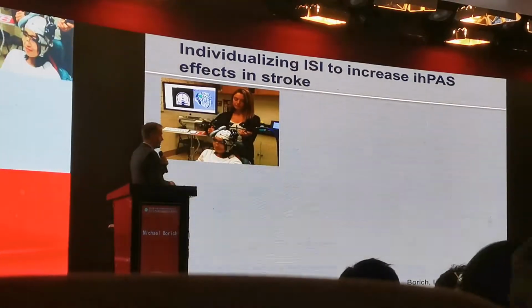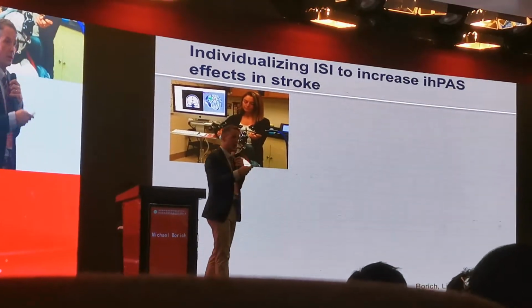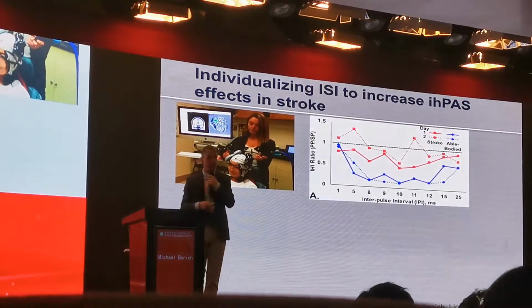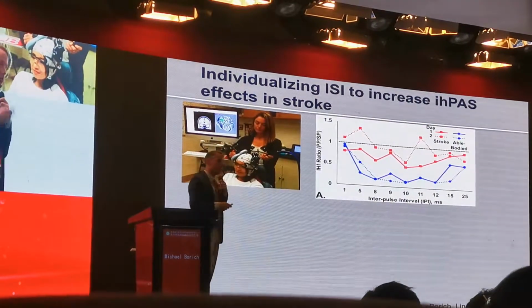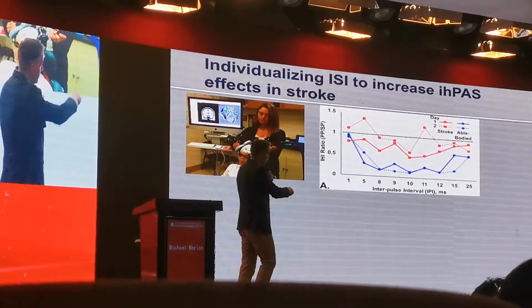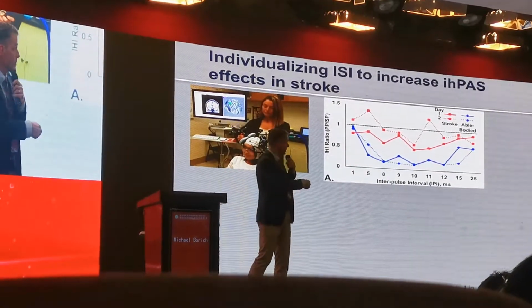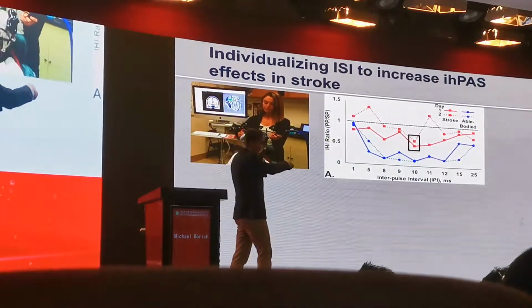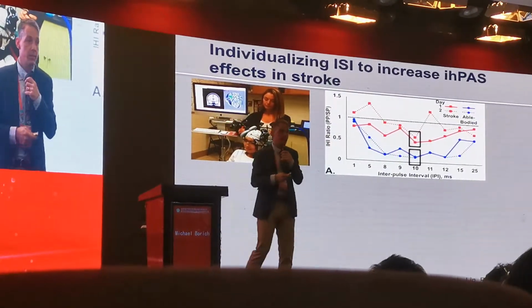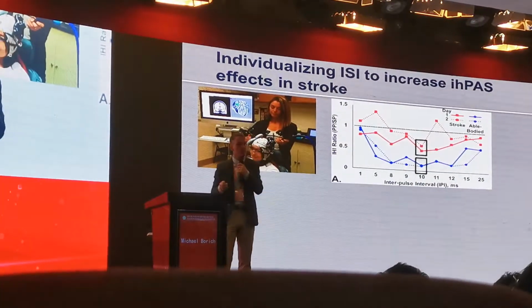So we've developed an approach to try and look at the relative differences in the timing of signal conduction between these pathways using an approach called interhemispheric inhibition, where you pair two stimuli in a given period of time, and if you get the timing right, you will actually see a reduction in the output, the MEP, the peripheral output, compared to when you don't pair the stimuli. So what we do is find the timing, i.e. the interpulse interval, where we get the maximal inhibitory effect, given that this, we think, is the timing that is optimal for synchronizing inputs between the hemispheres.